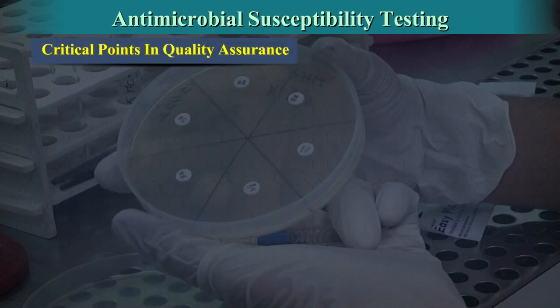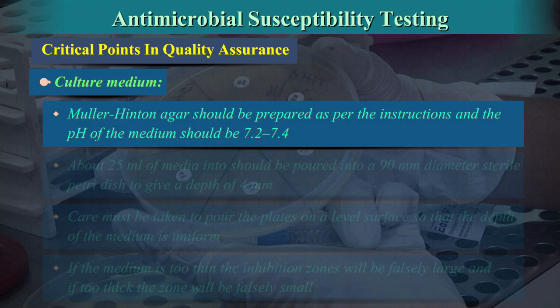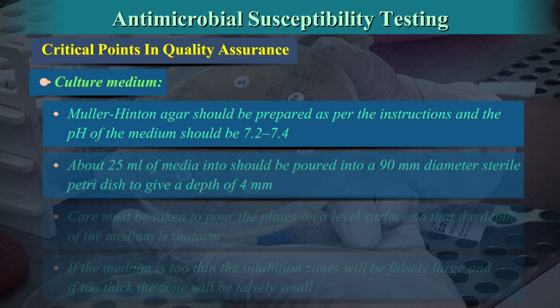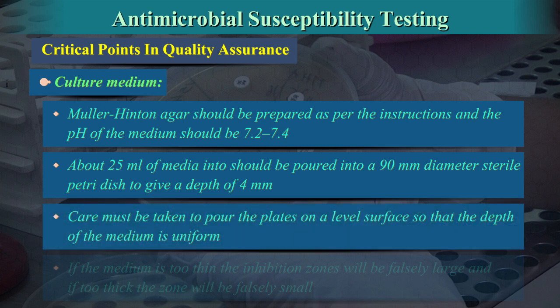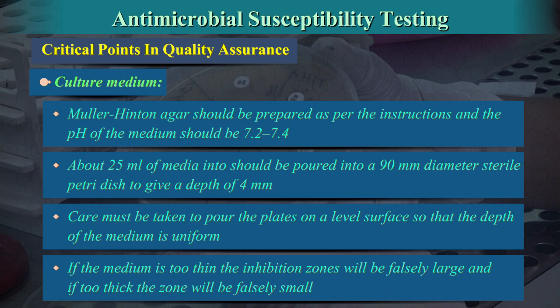Critical points in quality assurance: Mueller-Hinton agar should be prepared as per the manufacturer's instructions and the pH of the medium should be 7.2 to 7.4. About 25 ml of media should be poured into a 90 mm diameter sterile Petri dish to give a depth of 4 mm. Care must be taken to pour the plates on a level surface so that the depth of the medium is uniform. If the medium is too thin, the inhibition zones will be falsely large; if too thick, the zones will be falsely small.